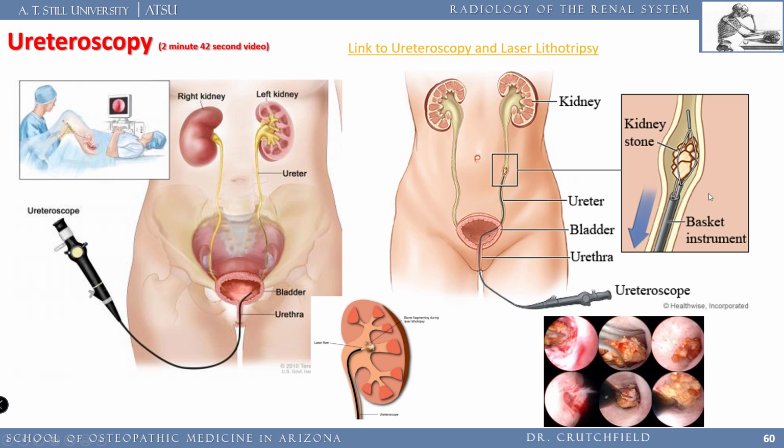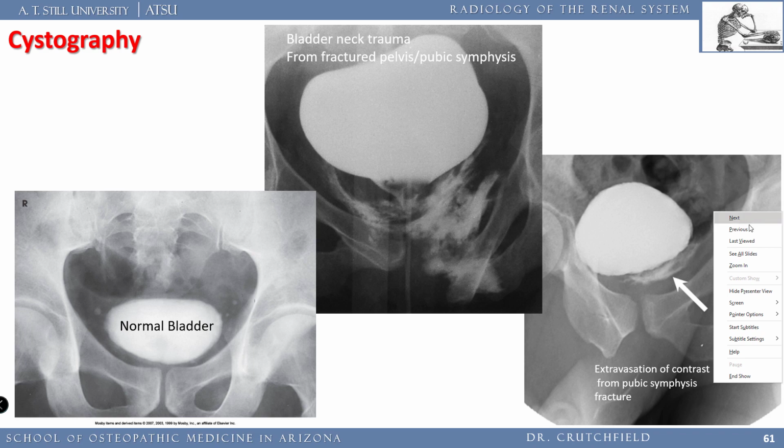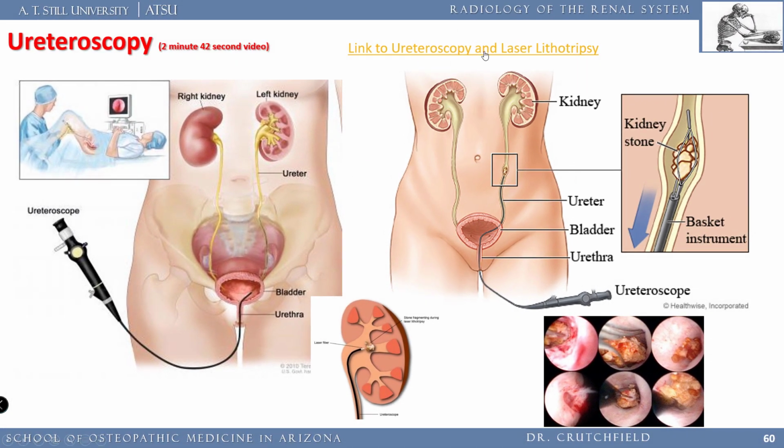And sometimes we go up there and guess what? We can find, you guessed it, stones, and we can take those stones out like what we're seeing here. Some stones get really pretty big, and you can go up and get them out this way. You also can do lithotripsy, and there's a link here that shows them using sound lithotripsy and also laser lithotripsy to get those stones out.